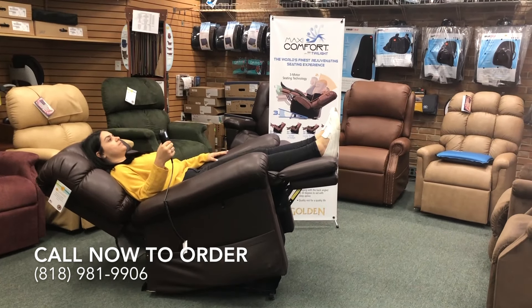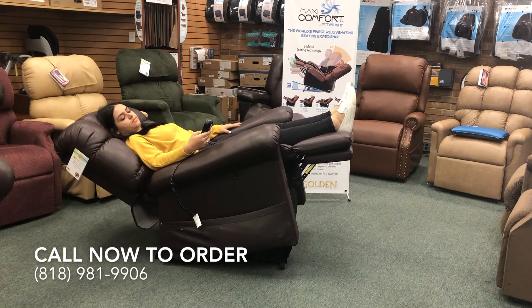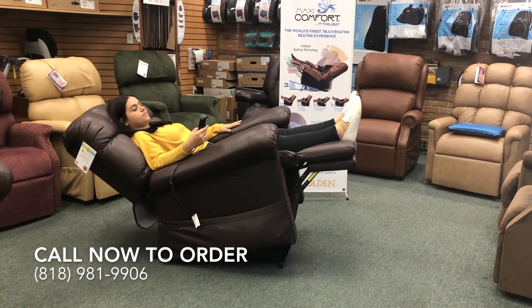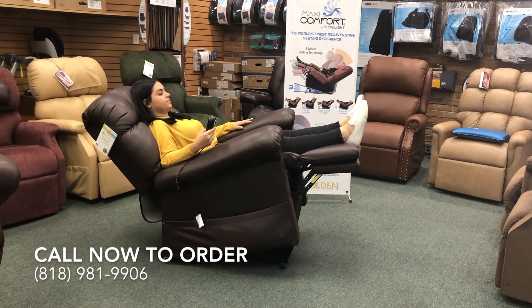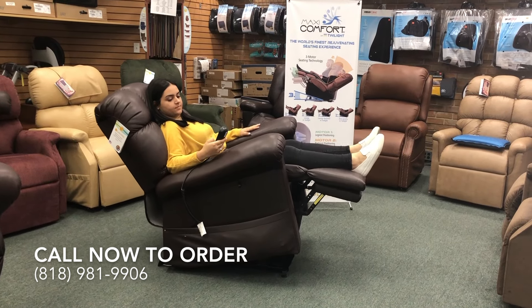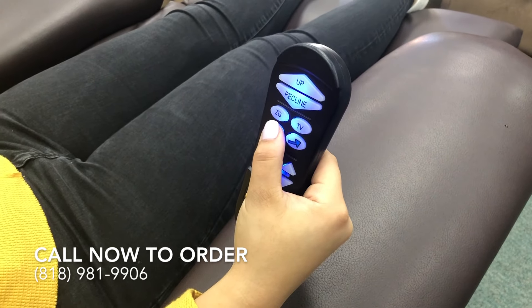Since this is an infinite position chair, you can still customize your legs and back to whichever position is most comfortable for you. To come out of twilight positioning, simply press the left side arrow and the chair will lower.